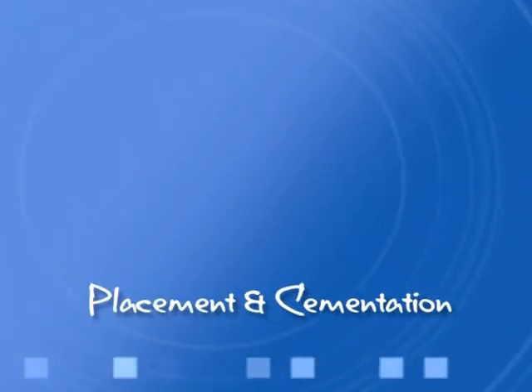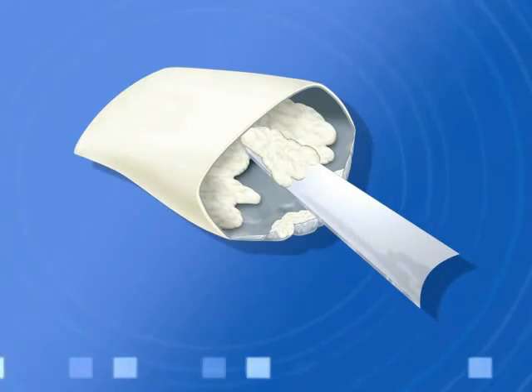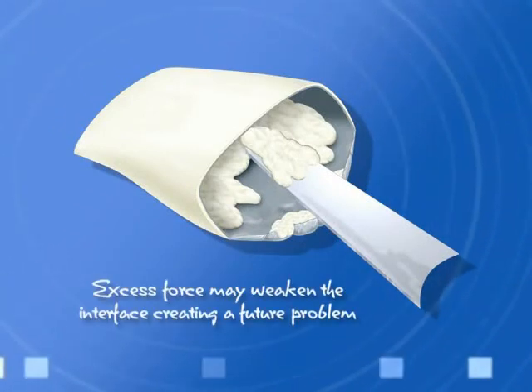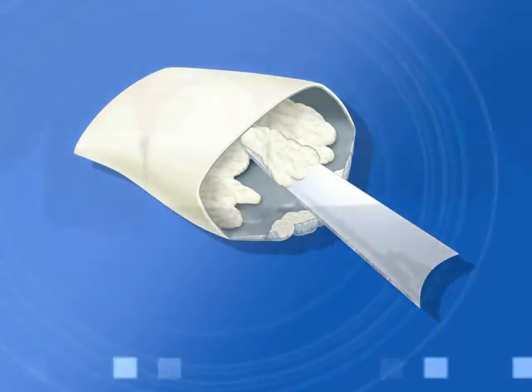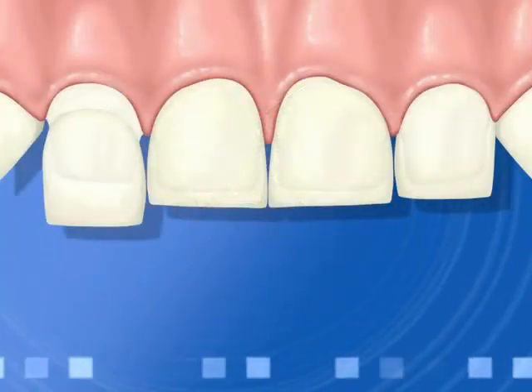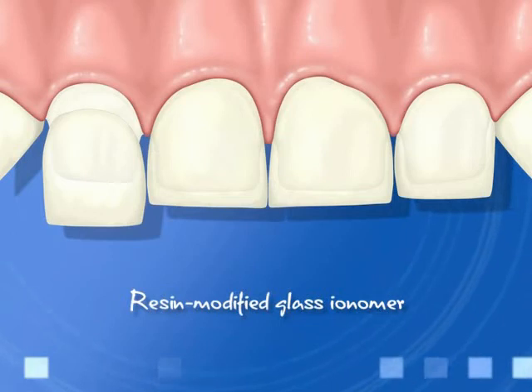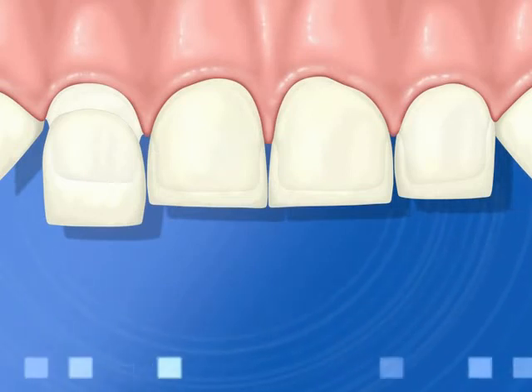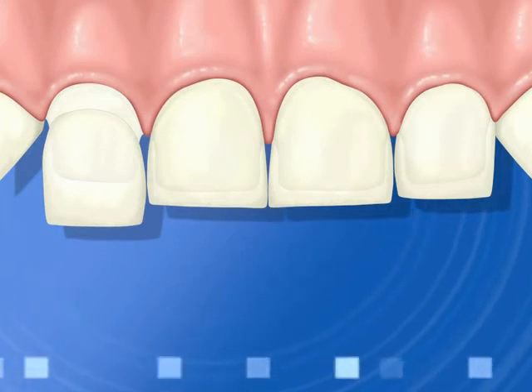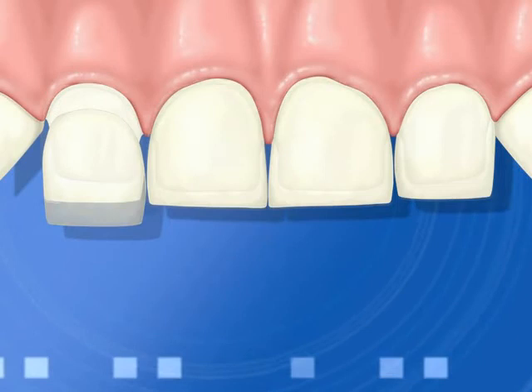Placement and cementation. Use light finger pressure when putting the crowns to place. Excess force may cause a crack or weaken the interface, creating a future problem. Whatever you use to cement regular stainless steel crowns can be used to cement Kinder crowns. The cement of choice by the majority of dentists is resin-modified glass ionomer, although straight glass ionomer is certainly adequate. The fluid nature of glass ionomer also helps avoid air bubbles.